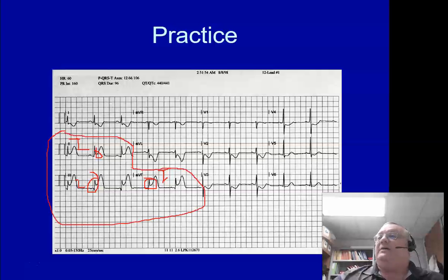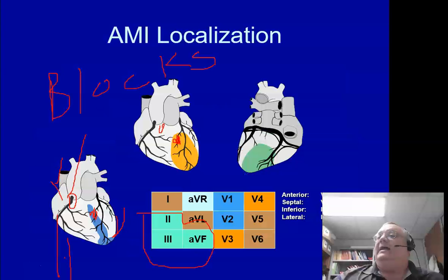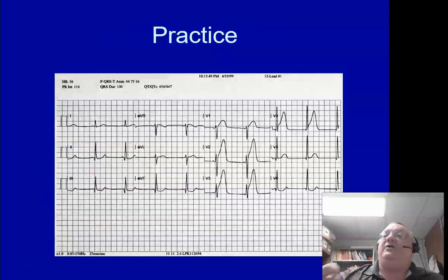Remember, if we go back, we click back to this last slide. Again, if it's the right wall of the heart that's being affected, okay, that inferior wall, if it's being affected down here, guys, if you kill that right wall, you kill that filling, you kill the preload coming back into here, I assure you, they're going to get sick quickly. And matter of fact, when you give these guys nitrates, they die on you.